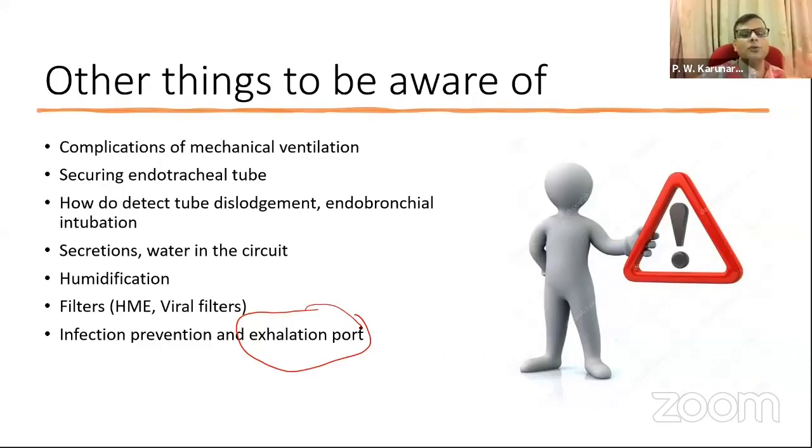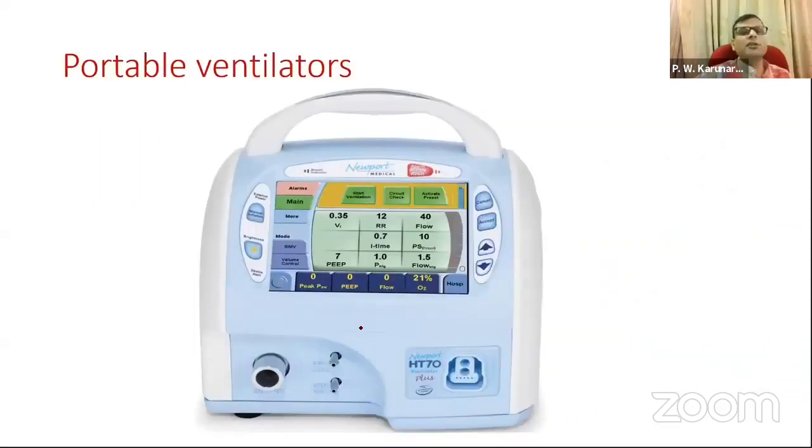So you don't attach anything to the exhalation port. When you don't know about the ventilator, you may be worried about all the gases coming out, and people do various things, especially less experienced people. Don't try to tamper with the exhalation port. So I'm going to show you certain portable ventilators.